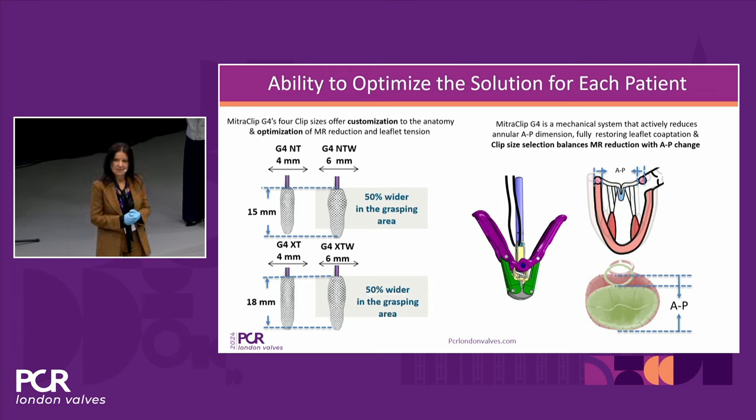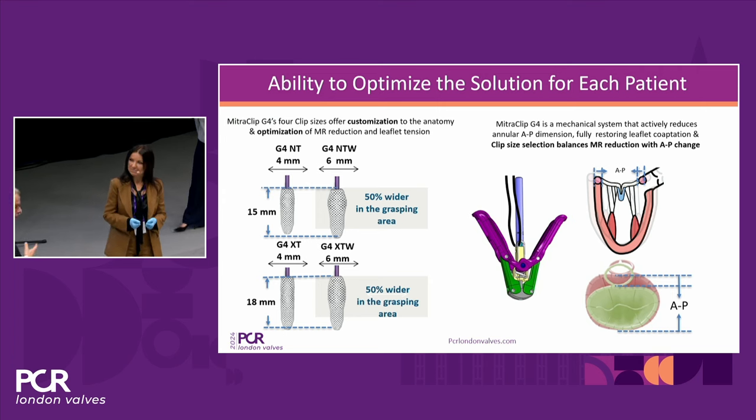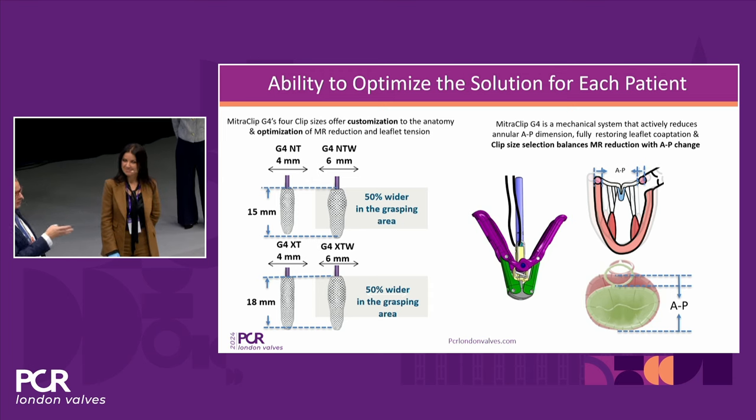The MitraClip G4 system also is a mechanical system, so it actively reduces the annular AP dimension, and in doing so, fully restores leaflet coaptation. And so you can select your clip size to manage MR in balance with that AP dimensional change. And that is an important aspect of also the decision making in such a procedure.